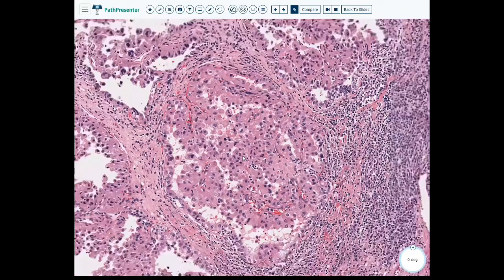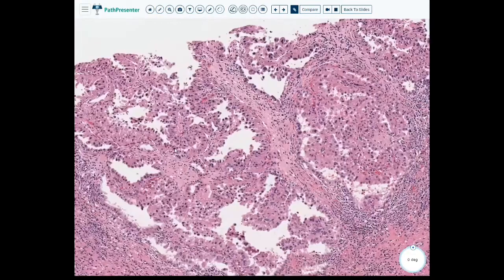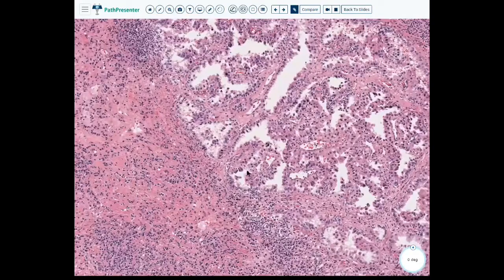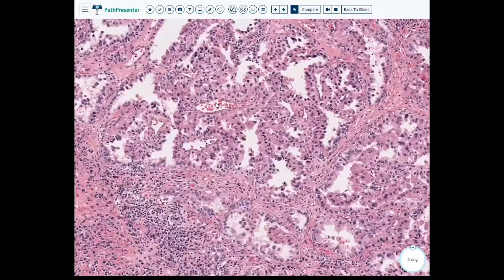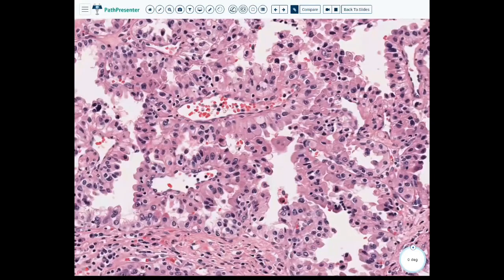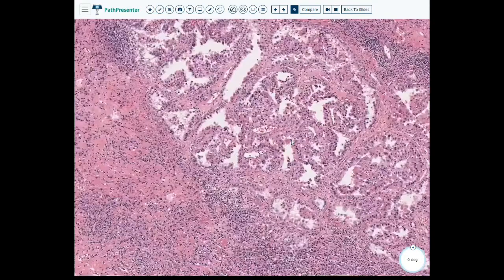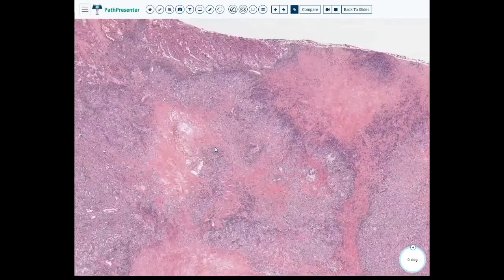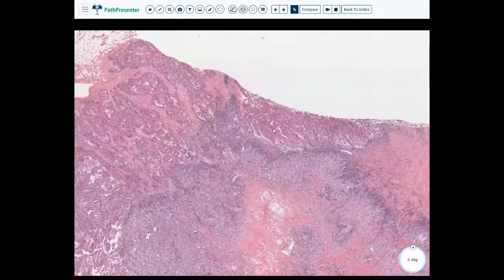Okay, I don't think it's really gonna play too nice with us. And maybe this one we should leave more at a differential. Like there is some clearing that would push us towards a high grade clear cell renal cell carcinoma.